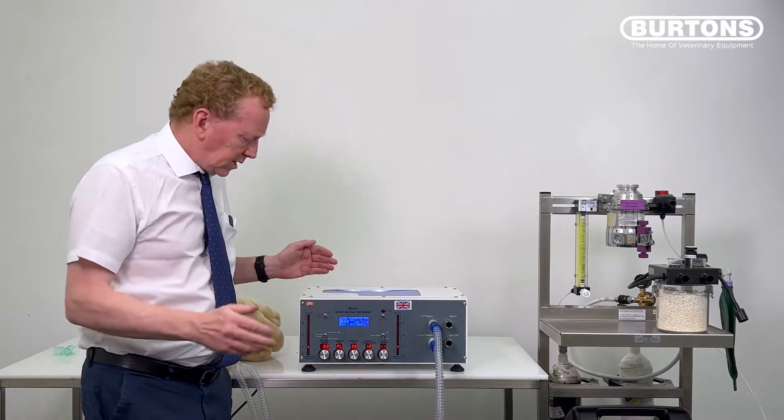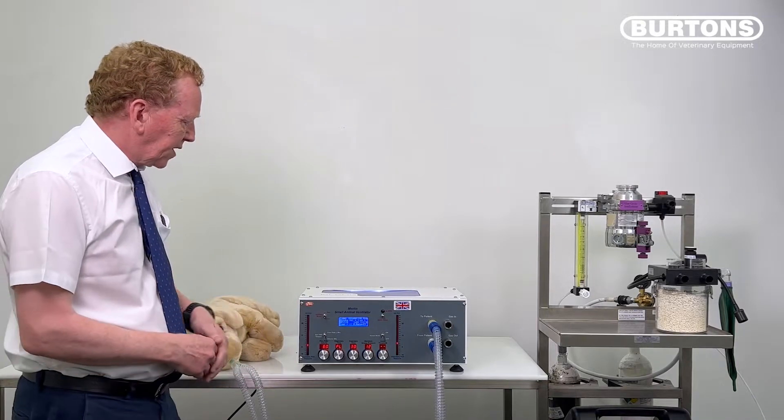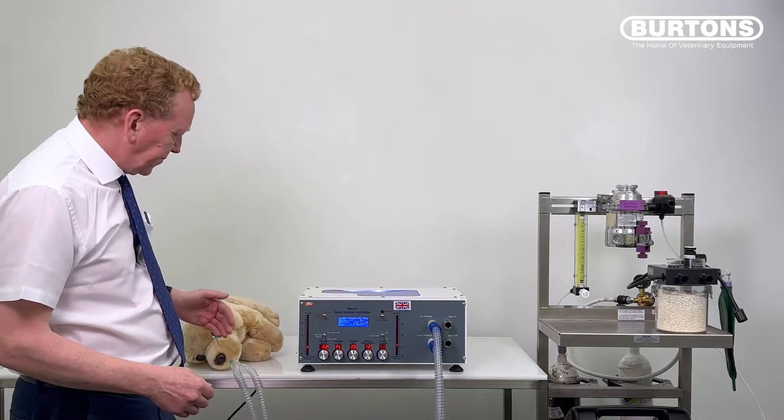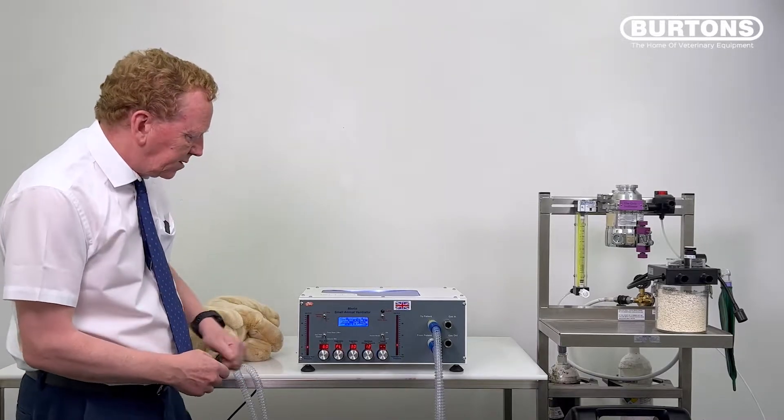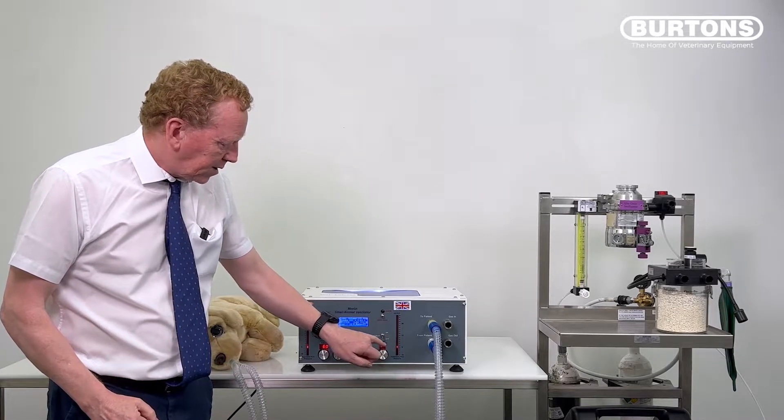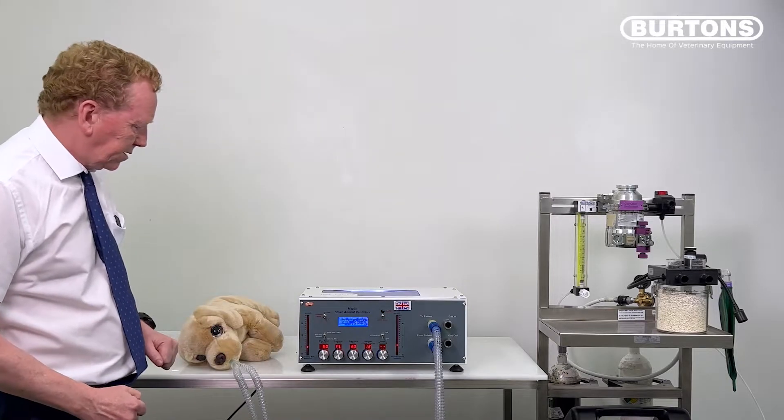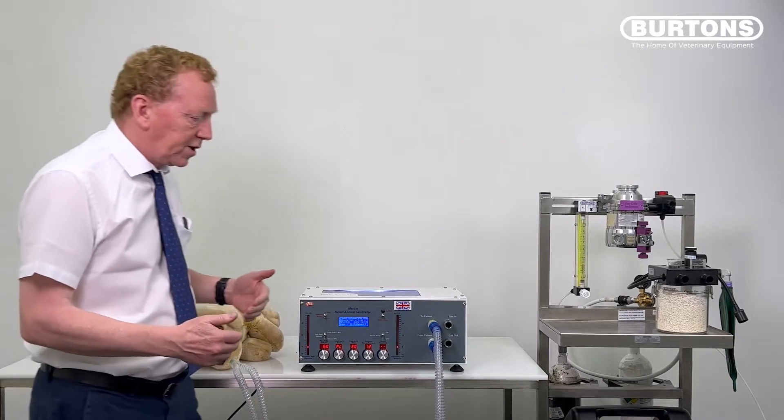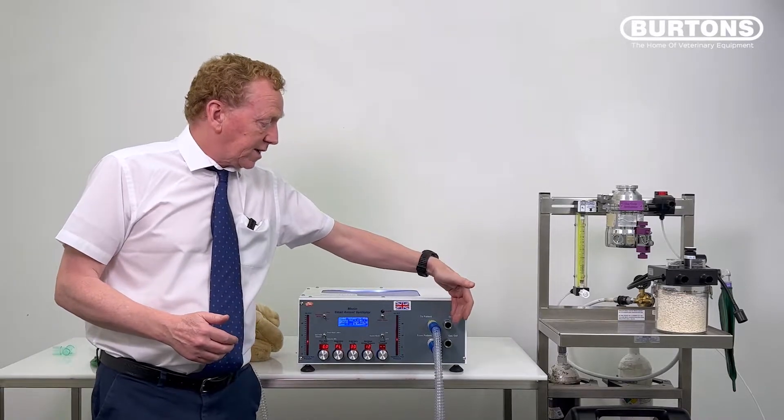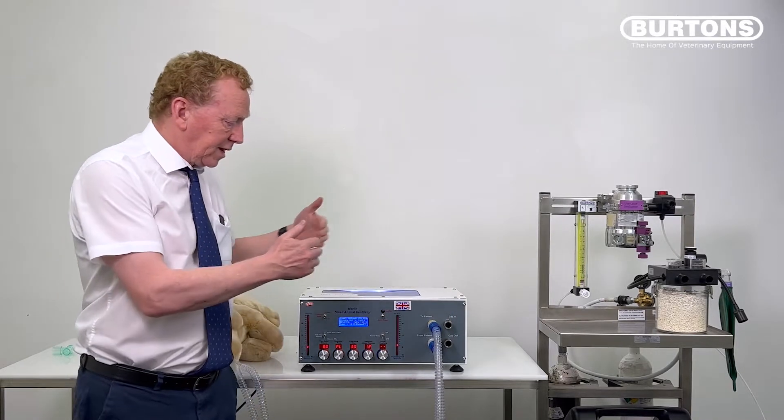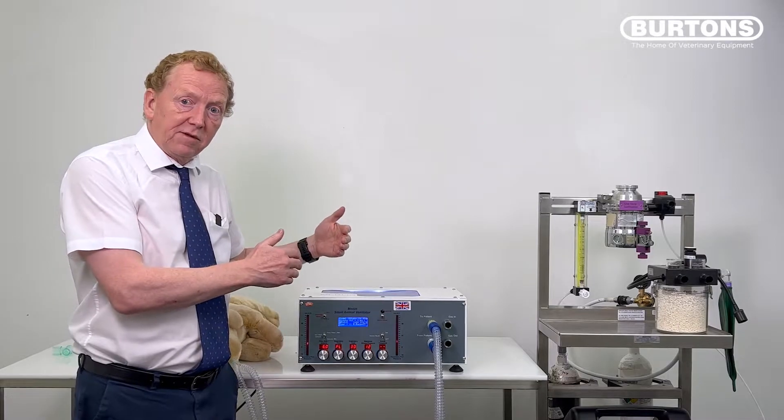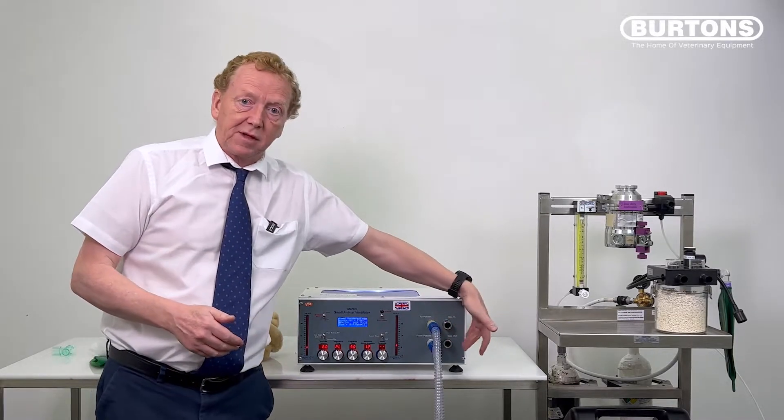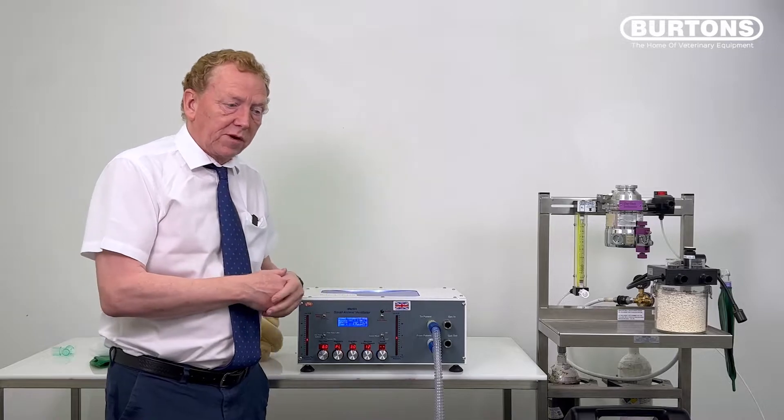So I've got the machine set up here to ventilate a small dog and we put it to run. Then it pushes gas in. We're getting a pressure of about 12 centimetres. We see the airway pressure go up here. Got an airway pressure on the screen at 12. See the animal just breathing slightly. That's normal operation and what Merlin is doing is taking in gas through the gas in port, filling up the cylinder, using that gas to deliver it to the patient. The end of the breath has been voided out through the gas out port. So very simple operation.